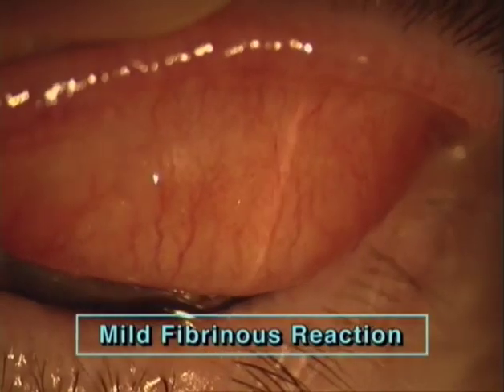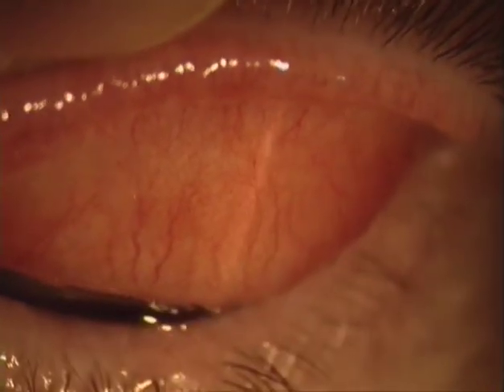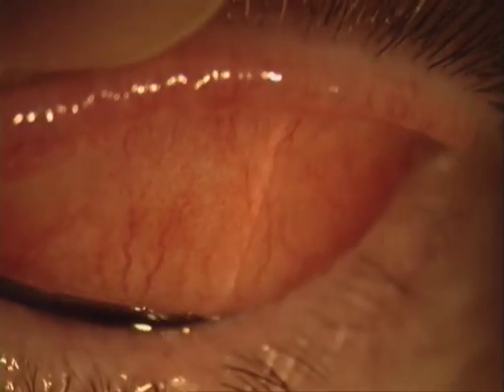In this case, the layer is almost transparent, and thus its detection is even more difficult. The underlying vessels appear quite distinctly, and there seems to be no haziness. We have to rely on indirect signs for a diagnosis, such as the immobile air bubbles trapped in the sticky layer here.